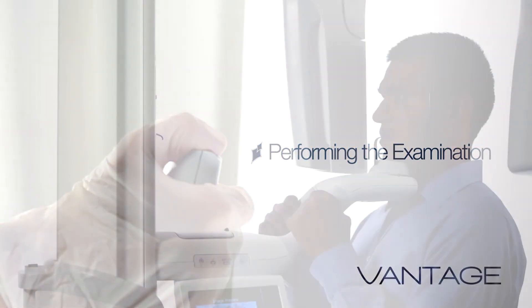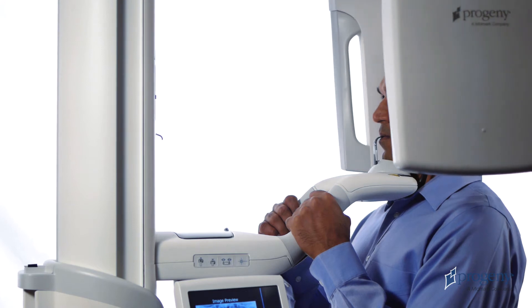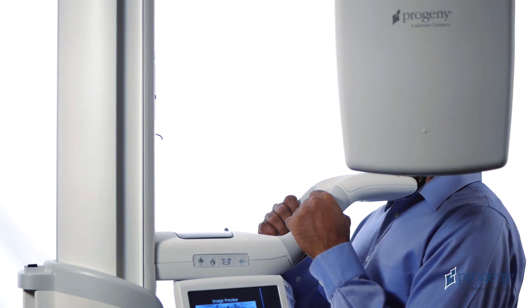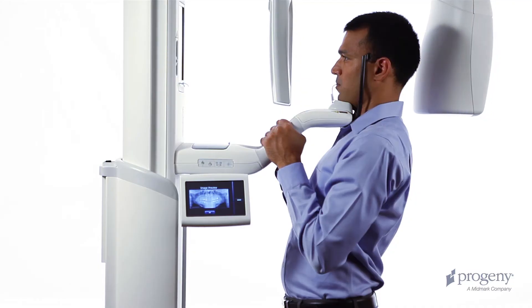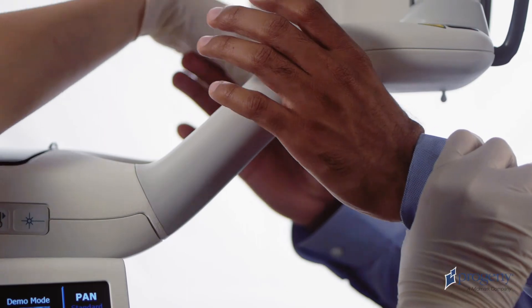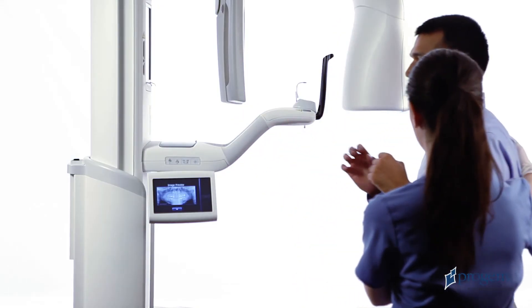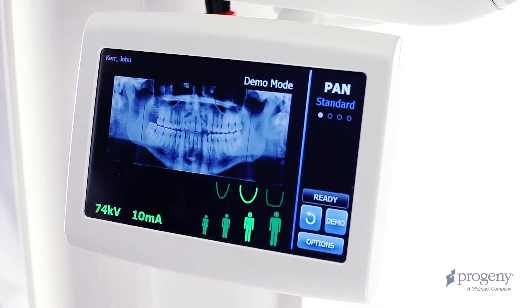Perform the examination. At the end of the exam, the overhead structure drives to the patient exit position. Advise the patient to remain in place until the overhead comes to a complete stop. At the end of the return movement, the head positioning wands will open. Assist the patient in stepping back and out of the structure. Tap OK to accept the image.